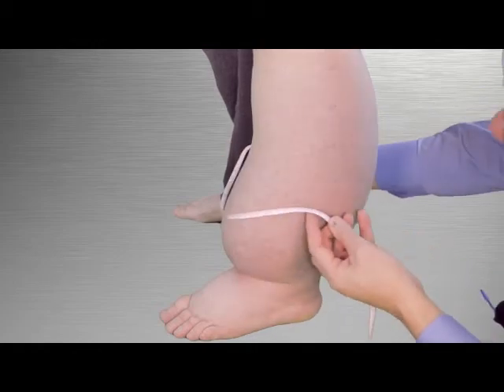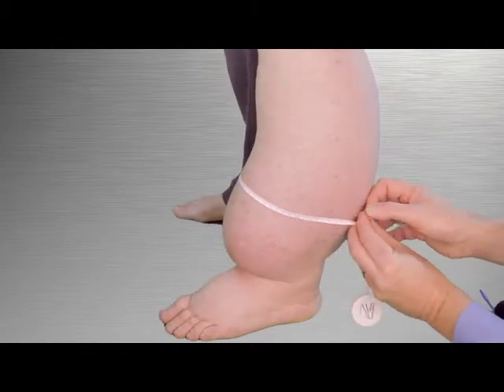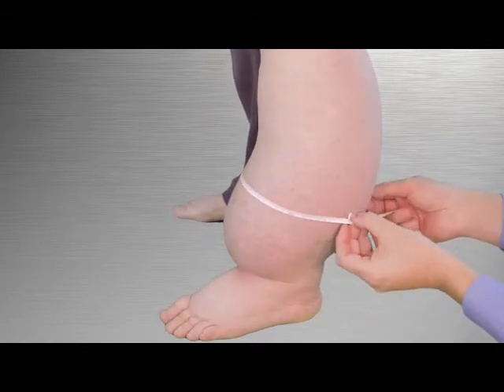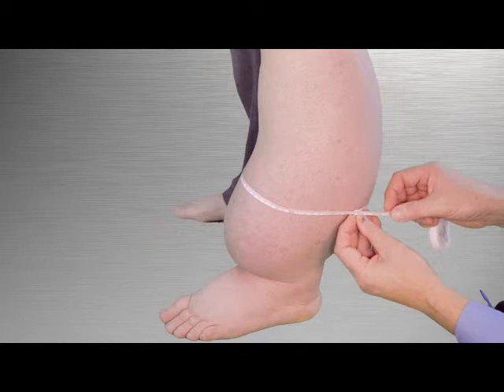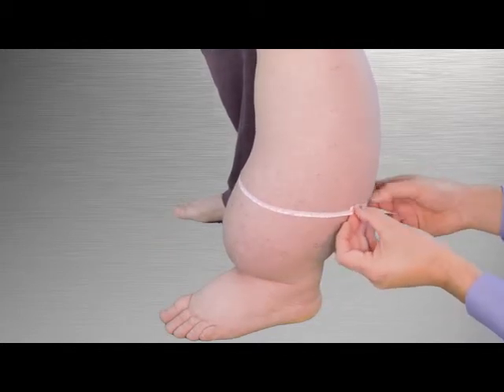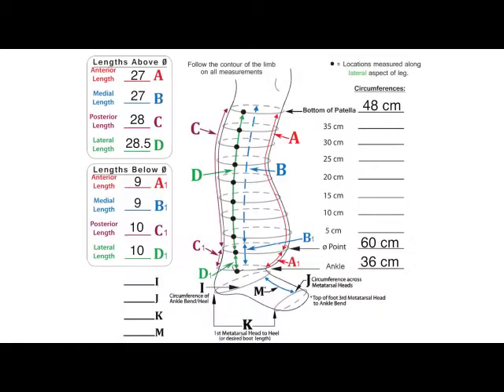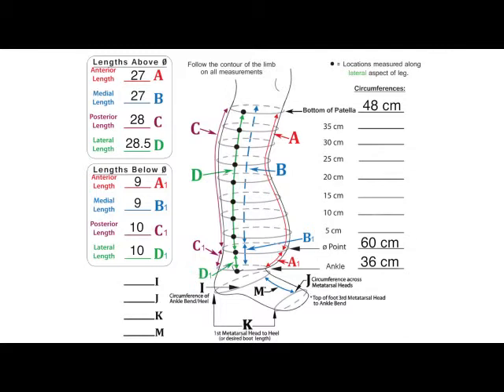The final step is to measure the leg circumference at each of the locations marked on the lateral aspect of the leg. Since the circumference measurements were previously recorded at the ankle and the zero point, the first circumference measurement is at the mark five centimeters above zero. Hold the tape lightly against the skin and record the value on the line labeled five centimeters in the circumference column.